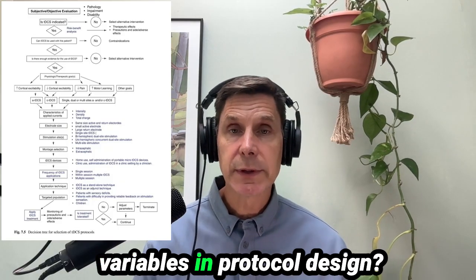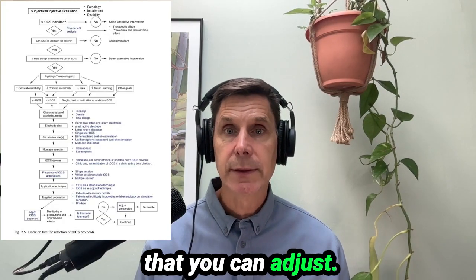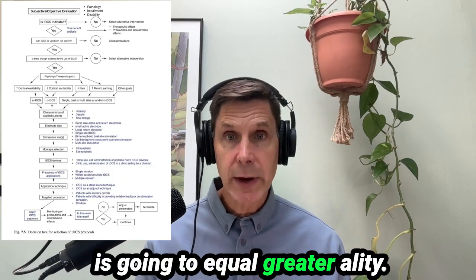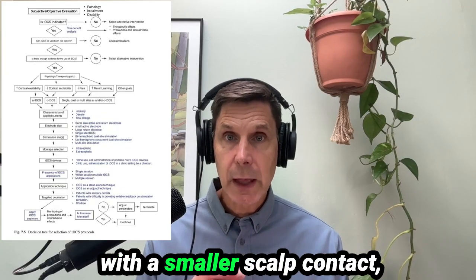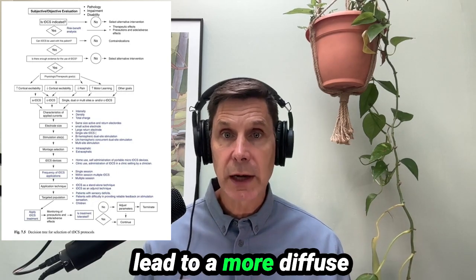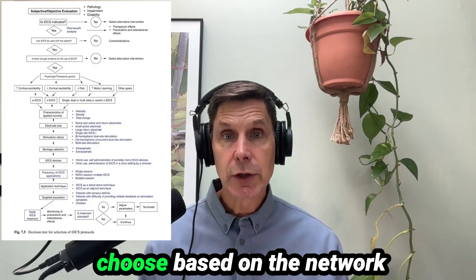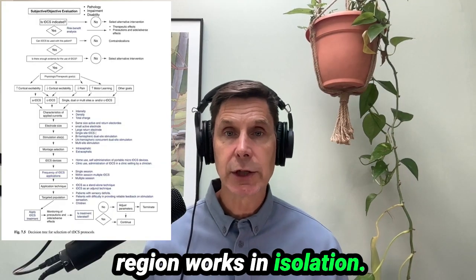So what are some key variables in protocol design? Let's talk about the big dials, so to speak, that you can adjust. The first is electrode size and placement. Smaller electrodes is going to equal greater focality. It's not hard to imagine that if you have a smaller electrode with a smaller scalp contact, it's going to lead to a greater focality of electrical current. Larger electrodes, on the other hand, are going to lead to a more diffuse current application. The second is stimulation site, which we're going to choose based on the network activity and not just that underlying neuroanatomy. Remember, no brain region works in isolation.